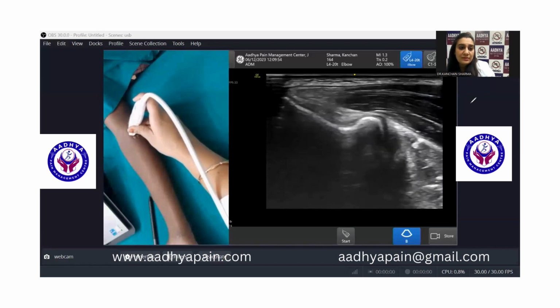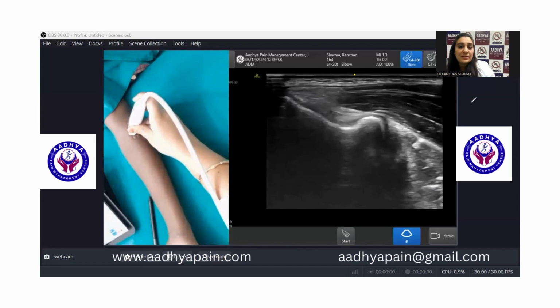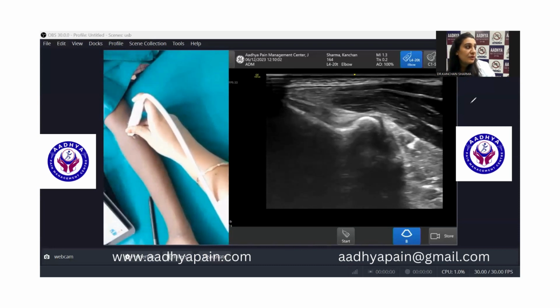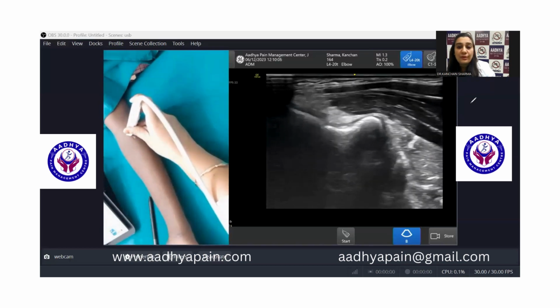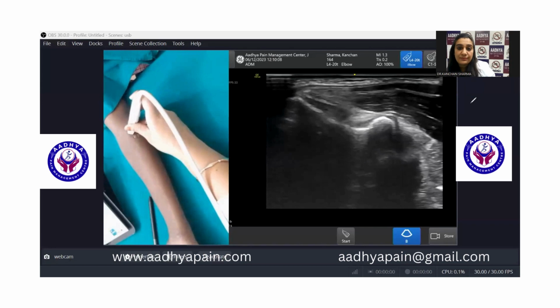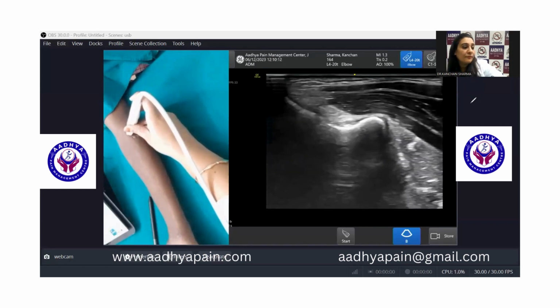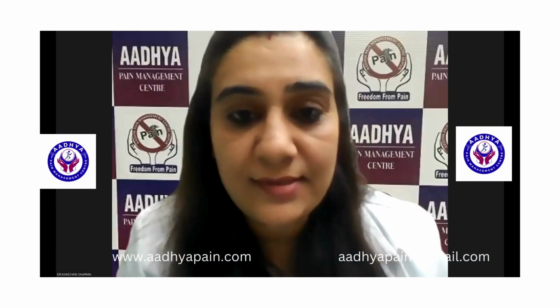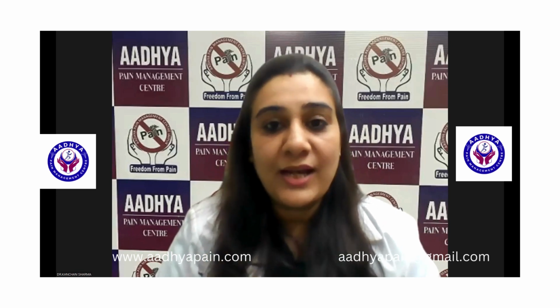At this moment, it is more or less in line with that. And now I'm able to see the tendinous portion very nicely. If you bring it a little more, you will be able to see much more of the tendinous portion. So that finishes your common flexor tendon in the longitudinal axis.